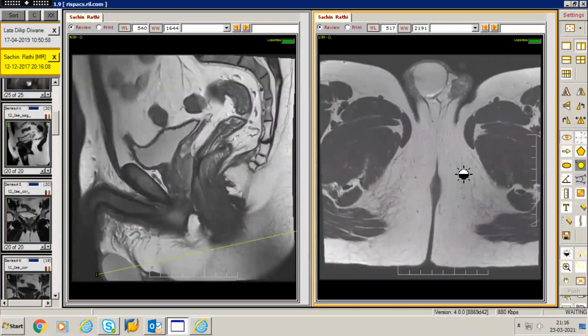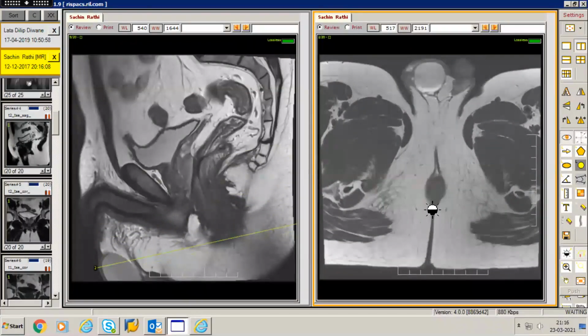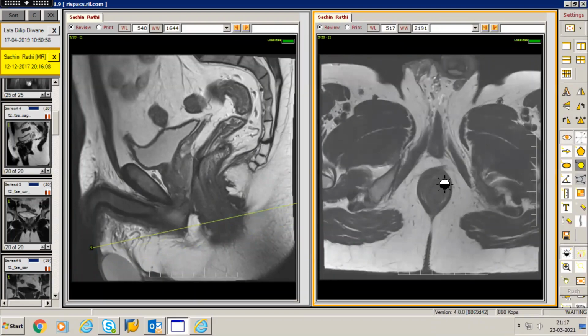Yeah, so I've come right at the bottom, at the level of the anal verge. If you can see these slender, thread-like structures peripherally, that would comprise the external anal sphincter. What you're seeing inside here is the rectum or the anal canal itself. And the muscle would then be referred to as the internal anal sphincter. Now, there are 3 components to the external anal sphincter: the outermost component, which is the subcutaneous portion, the superficial, and the deep.